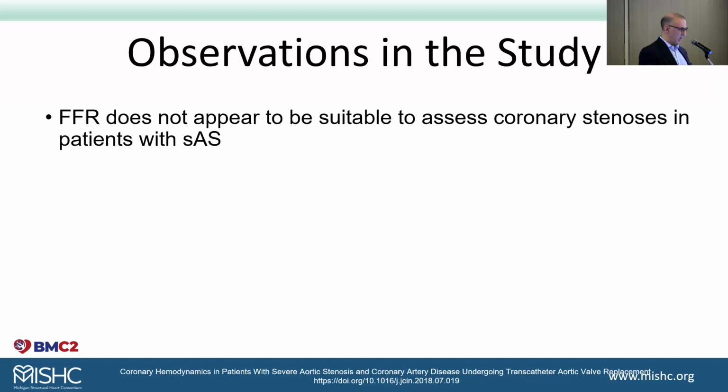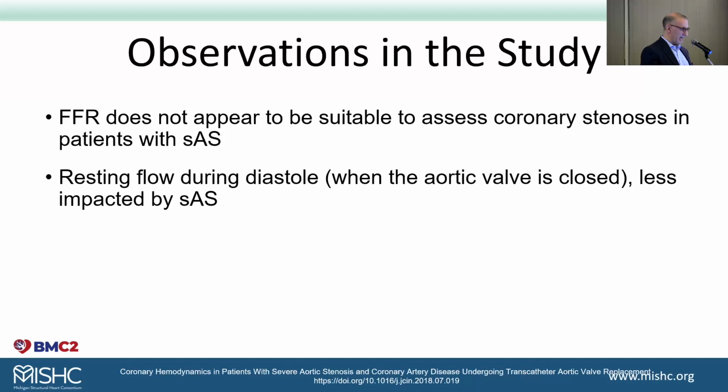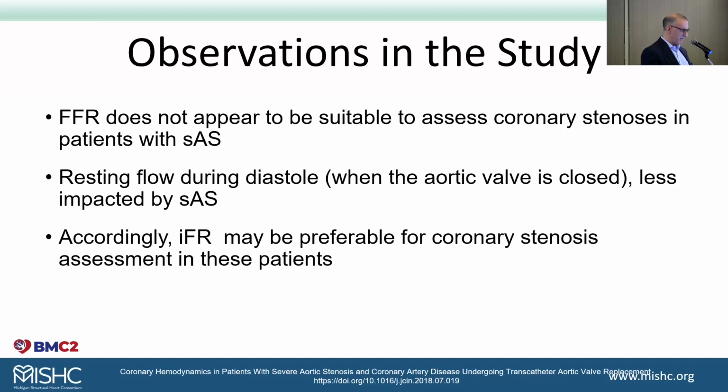So FFR does not appear to be suitable, apart from the fact of giving adenosine to someone with severe AS, to assess coronary stenosis in patients with severe AS. Resting flow during diastole, when the aortic valve is closed, is less impacted by severe aortic stenosis. Accordingly, iFR may be preferable for coronary stenosis assessment in these patients.